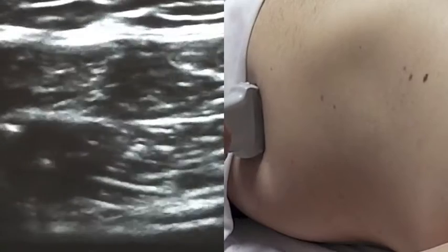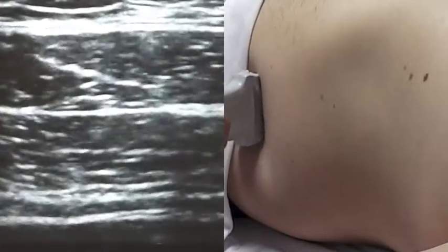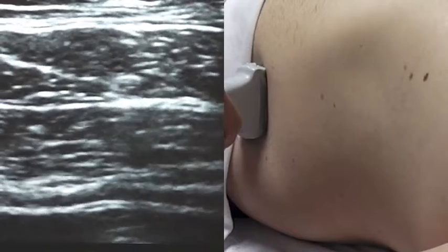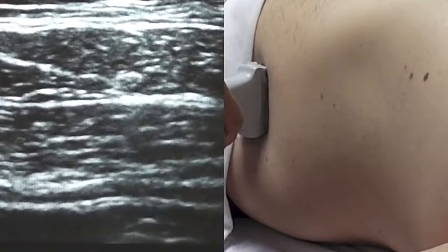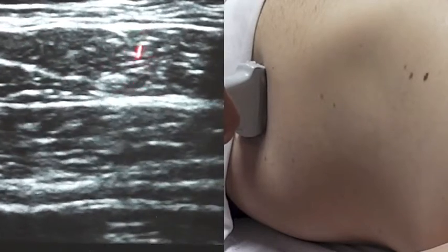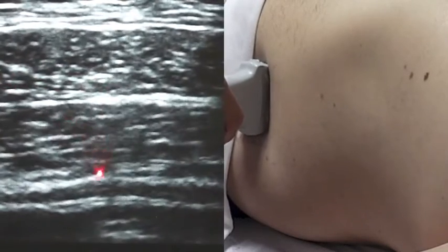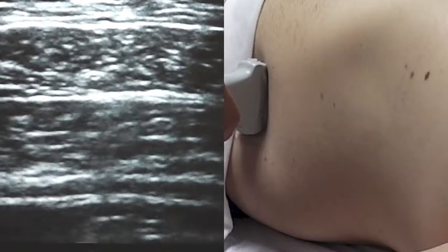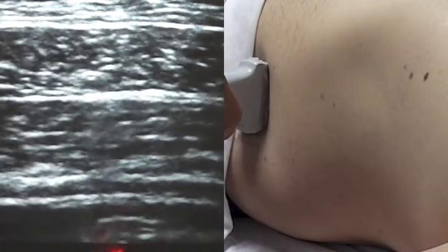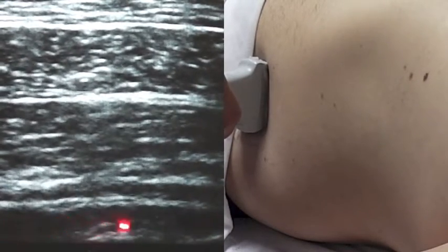For TAP blocks, we place our patients in the supine position on a stretcher, and we use our linear probe, placing it about the level of the umbilicus in the mid-axillary line. This is exactly what the image looks like in almost every single patient, the variable layer being the adipose tissue. There are three distinct muscle layers divided by fascial layers: the external oblique divided by fascia with the internal oblique, and the thinnest layer of the transversus abdominis. Below that, the white line is the peritoneum, and you can see bowel moving and peristalsing below the level of the peritoneum.